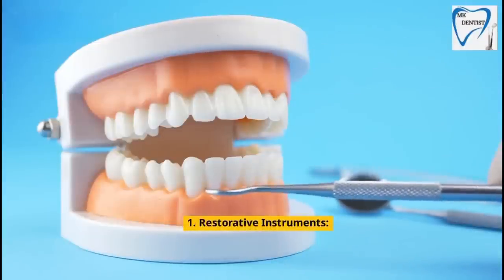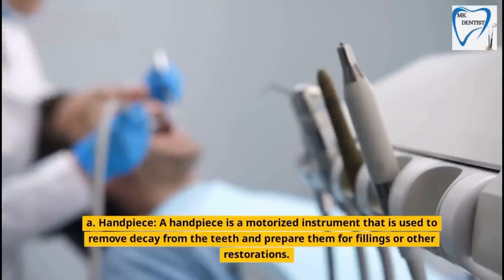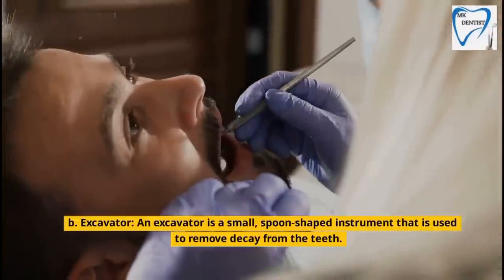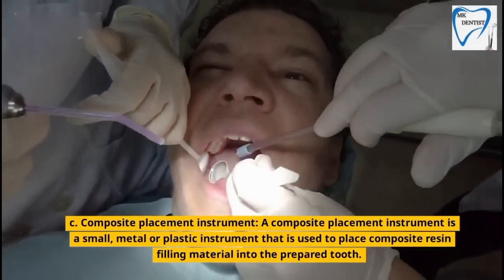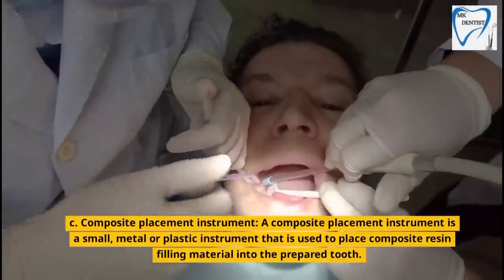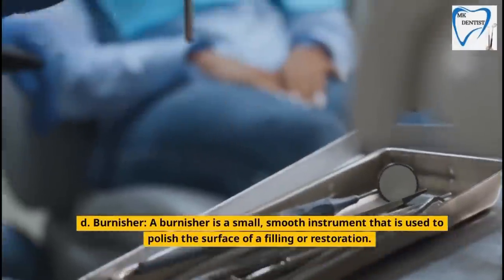Restorative Instruments. A. Handpiece — A handpiece is a motorized instrument that is used to remove decay from the teeth and prepare them for fillings or other restorations. B. Excavator — An excavator is a small, spoon-shaped instrument that is used to remove decay from the teeth. C. Composite Placement Instrument — A composite placement instrument is a small, metal or plastic instrument that is used to place composite resin filling material into the prepared tooth. D. Burnisher — A burnisher is a small, smooth instrument that is used to polish the surface of a filling or restoration.